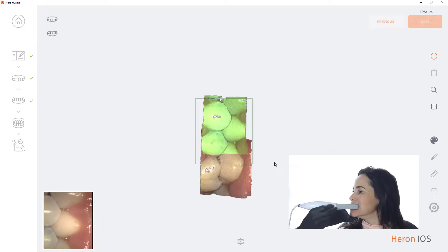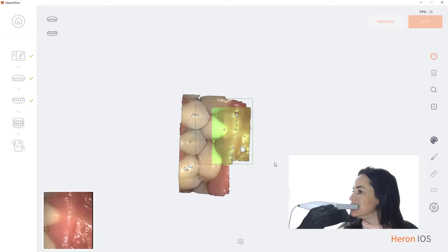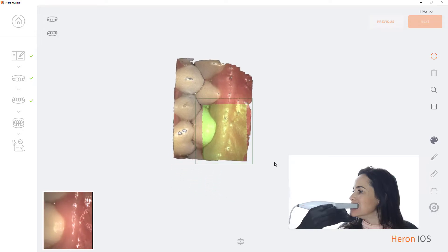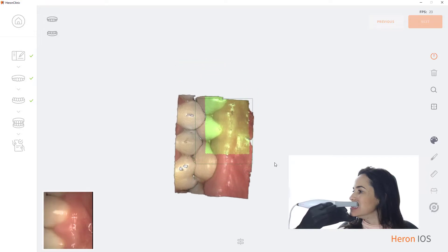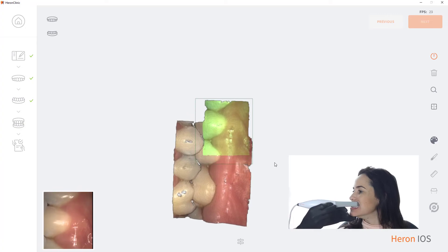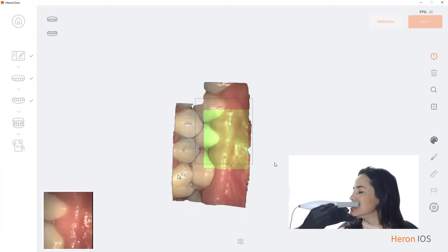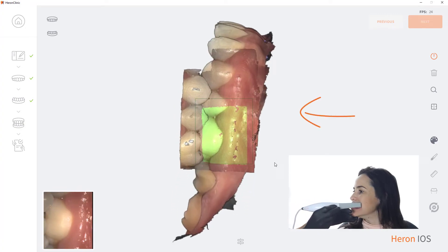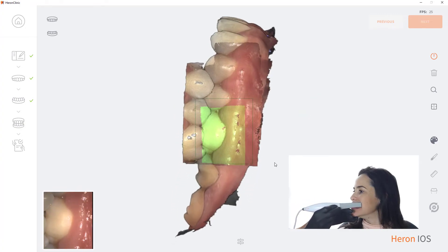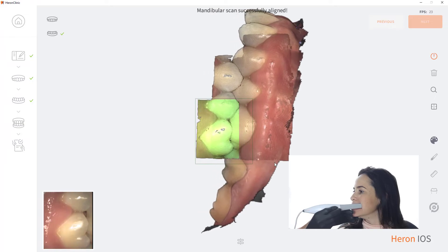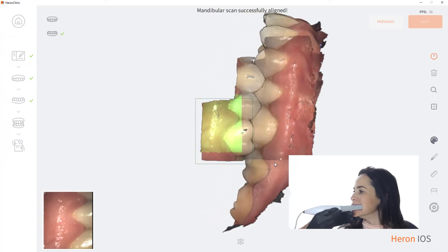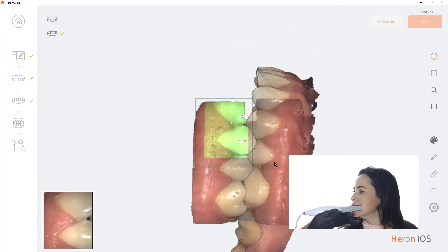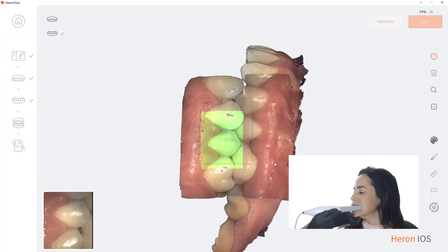Now it's time for the upper and lower arches to lock. After scanning the occlusal line, move the scanner down and continue scanning until the lower arch locks to the bite scan. Hover to the upper and continue until the locking is complete and the scanner turns off automatically.